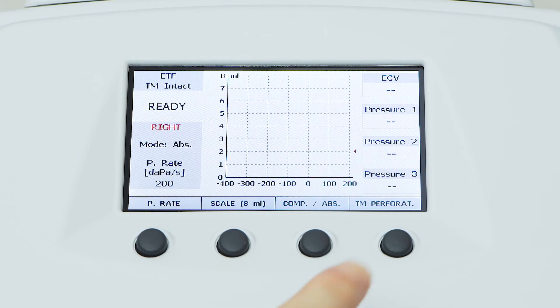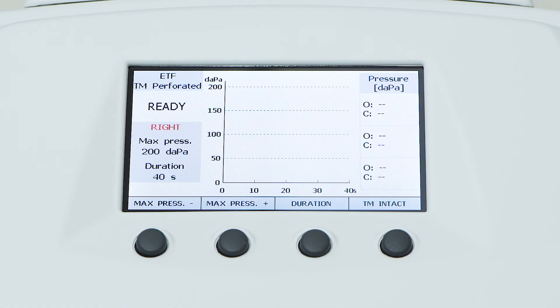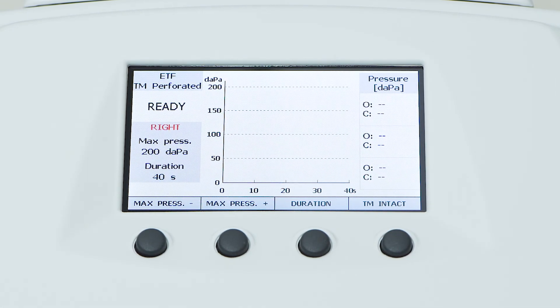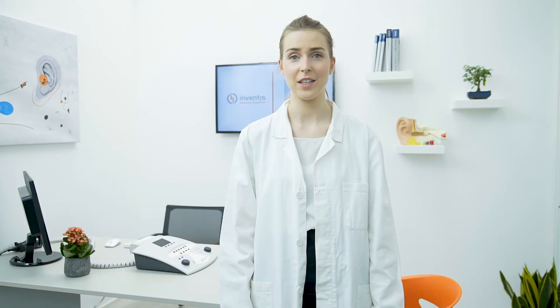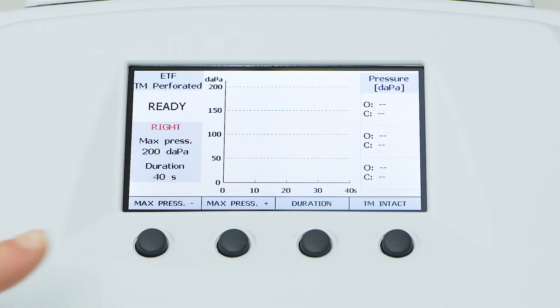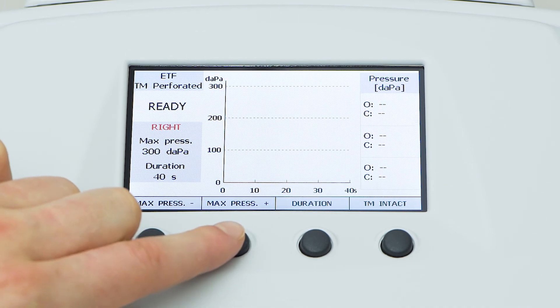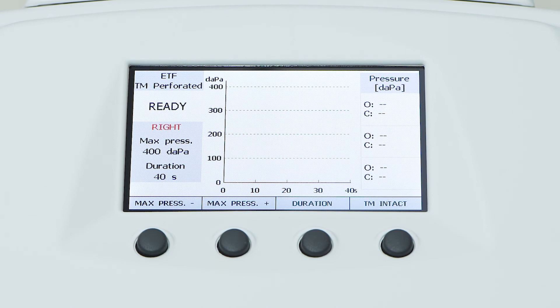The Eustachian tube function test for perforated eardrums can be performed simply by pressing the function button below the display of flute HF. The test is based on monitoring the pressure status of the ear canal after pressurization. All the parameters of the test can be set directly from the ETF screen. In particular, the user can select the pressure value to be set in the ear canal, choosing different values between minus 600 dPa and 400 dPa.